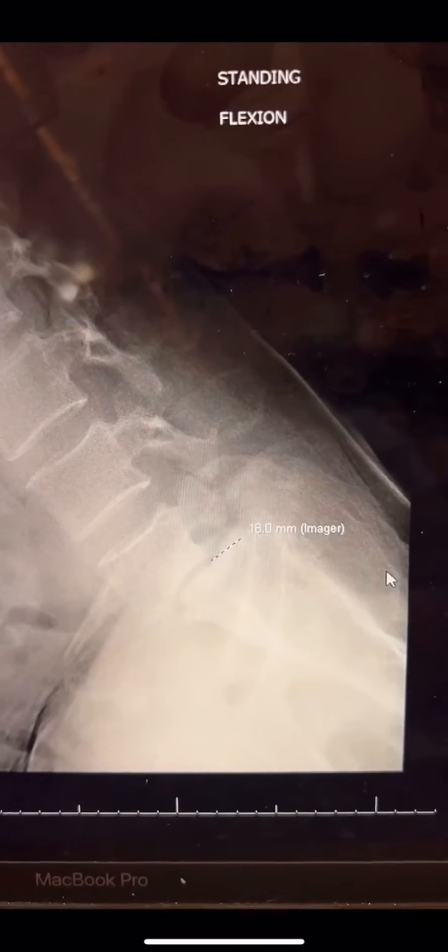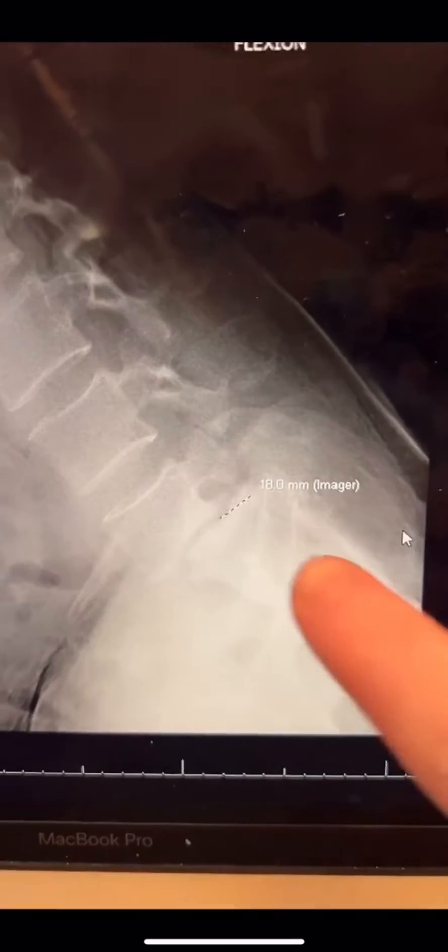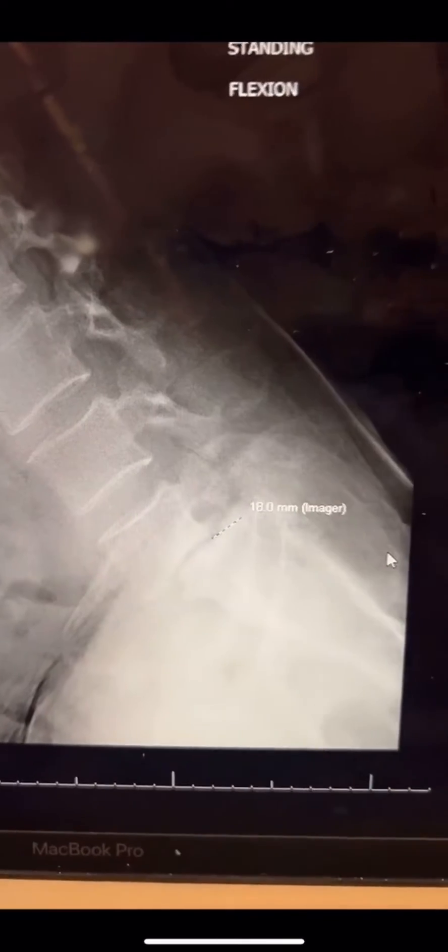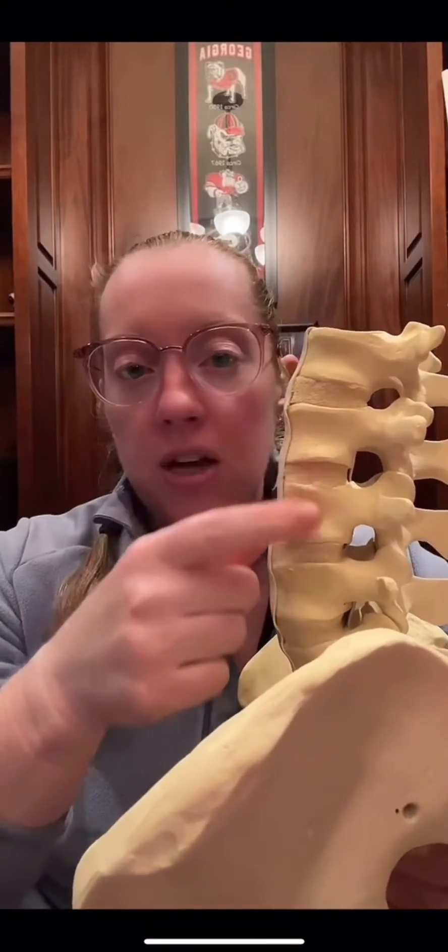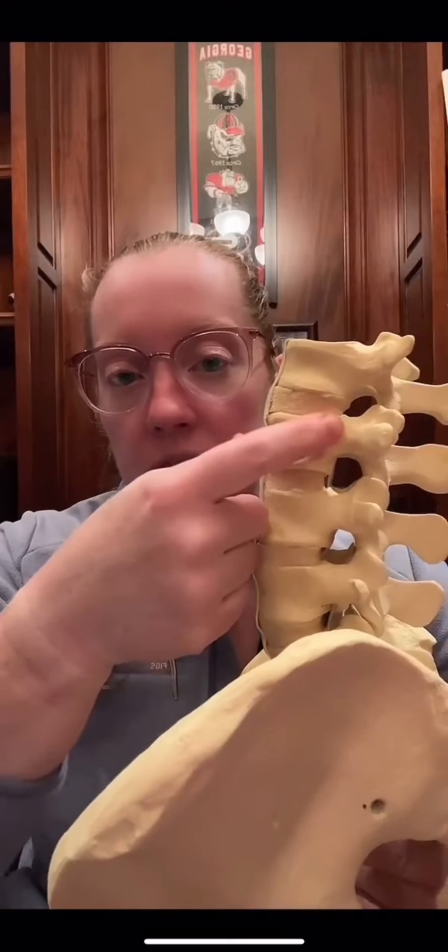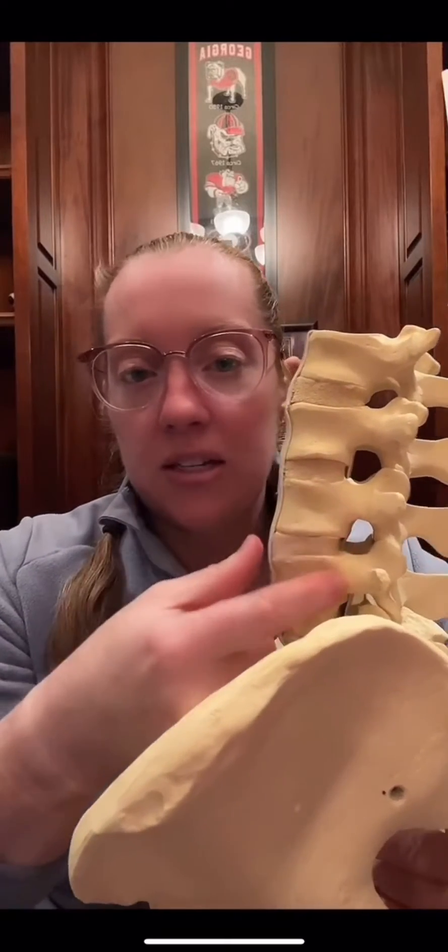On the flexion films, when he leans forward, it goes up to 18 millimeters. The bones in our spine should typically be aligned one on top of the other, with a straight line where they line up. This condition where one is shifted forward on the other is called spondylolisthesis — that's where you might hear the term 'slipped vertebra.'